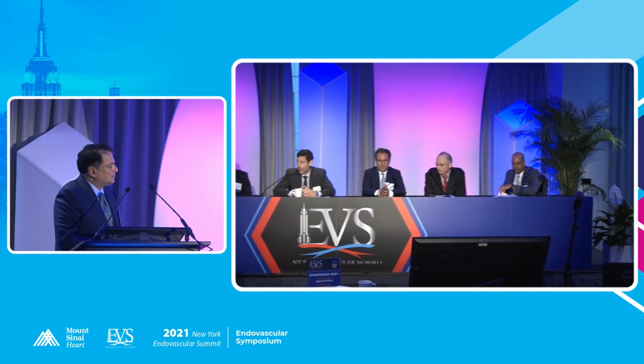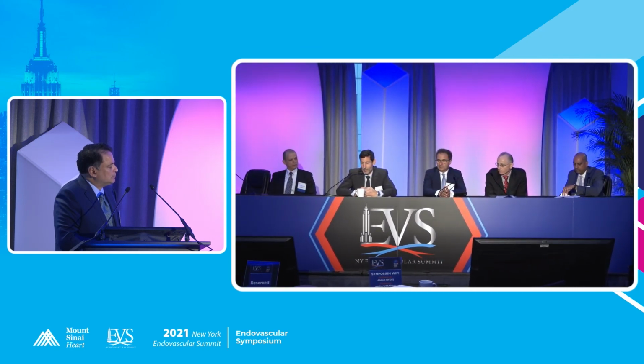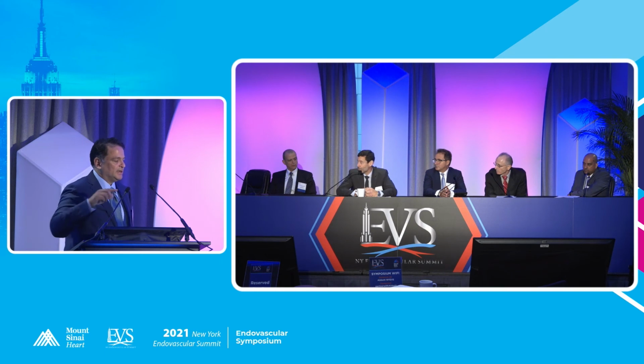I think Brian alluded to the Eluvia very well in his lecture. So he showed the data slide. Unfortunately, we don't have a lot of head-to-head trials on things, and so the question of DES versus Supera, I'd love to see that trial, quite honestly, because I don't know which one of those works better. I know I have my biases, but in terms of drug-coated versus drug-eluting stents, this is one place where we have a randomized trial that showed a difference between the two, and so that's why I think Eluvia at least has better data than Zilver, at least in a head-to-head at 1 year.